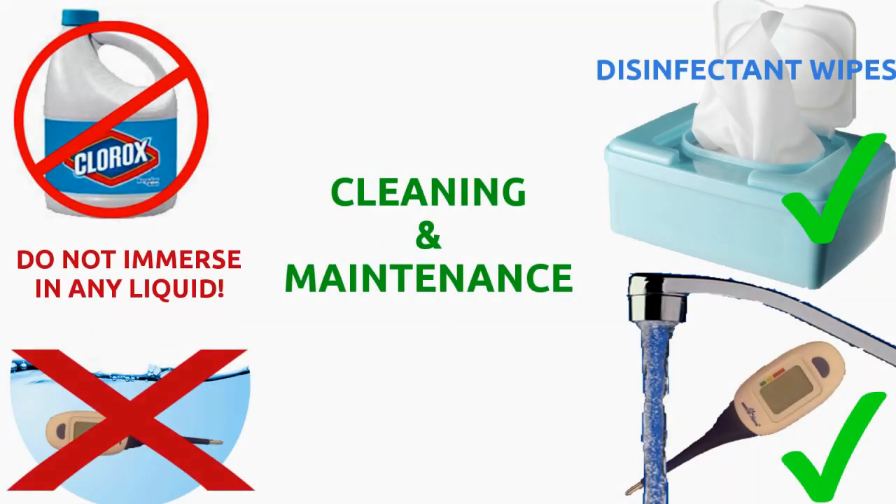For cleaning, I use a wipe moistened with rubbing alcohol or alcohol-based disinfectant wipes without chlorine. Rinse the tip only underwater with a neutral detergent. Please note that the water should not exceed 122 degrees Fahrenheit. Don't use bleach and don't immerse it in any liquid.